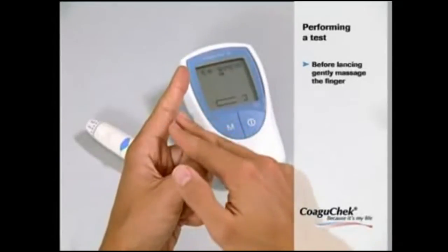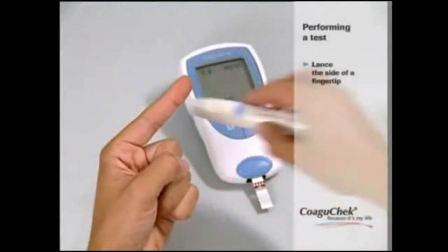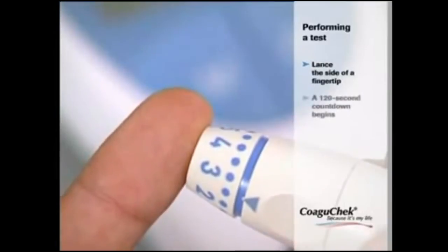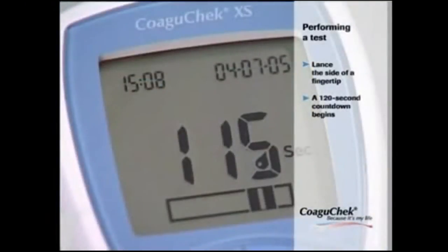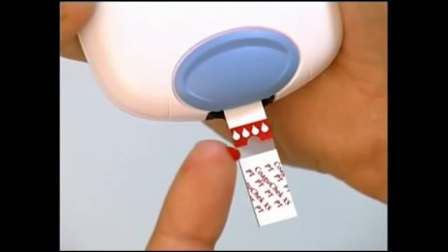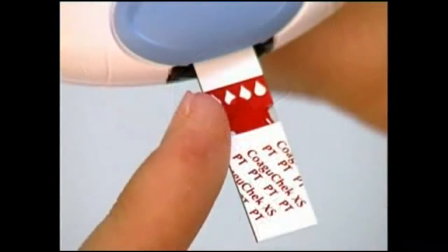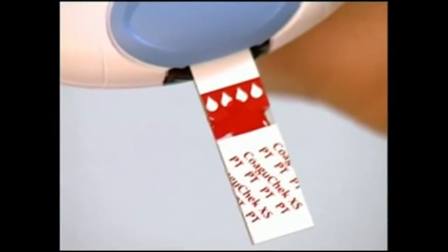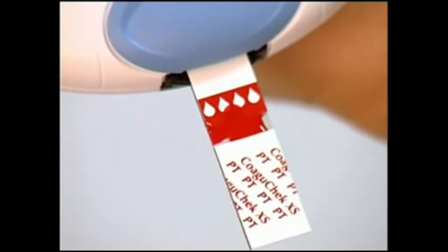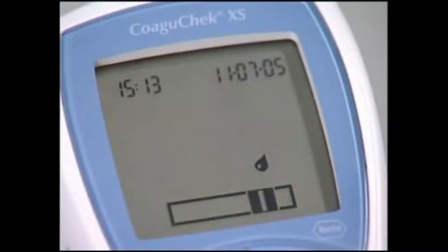Before you start lancing, gently massage the finger. Pick up the lancing device and lance the side of a fingertip when you see the 120-second countdown appear on the display. It is very important to apply the drop of blood within 15 seconds of lancing. Apply the blood drop to the side of the sample application area — you can also apply it to the top of the strip. The test strip draws up the blood by capillary action. When you have applied enough blood, the flashing symbol disappears, the monitor beeps, and the test starts.